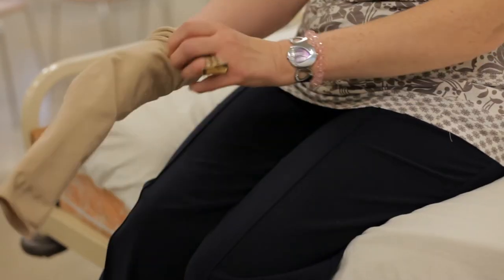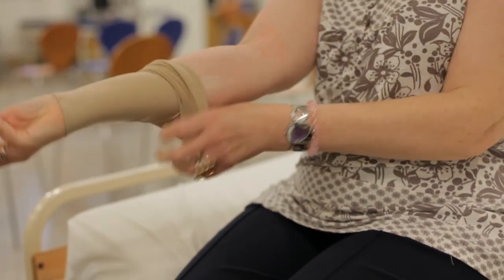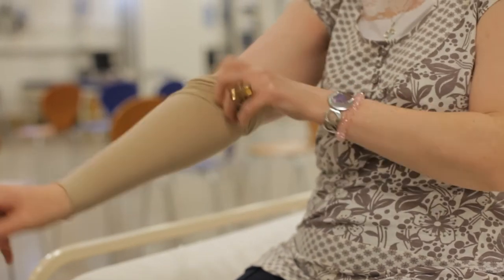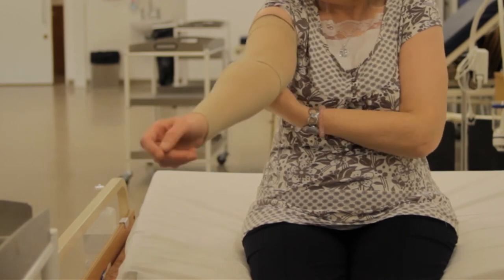First of all, take your lymphedema compression garment and turn it inside out. You'll be able to tell when it's inside out because the label is always on the inside of a garment. Put your hands or your foot through the bottom of the garment and then very slowly just roll up, taking a couple of inches at a time, easing the fabric up your arm or your leg.